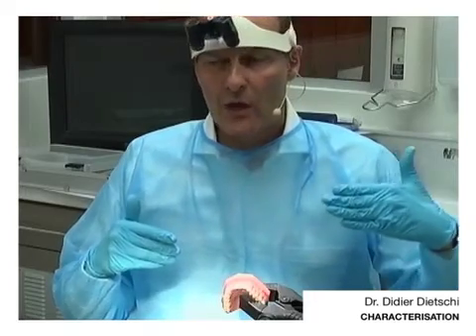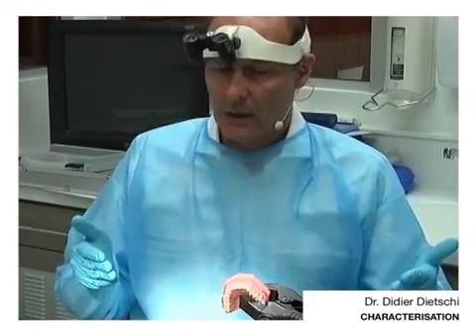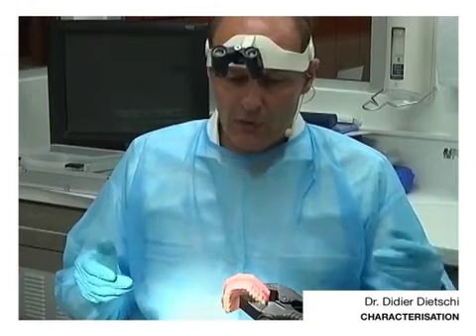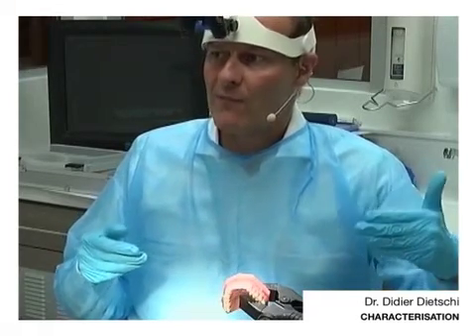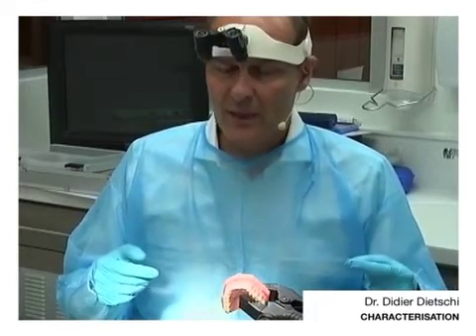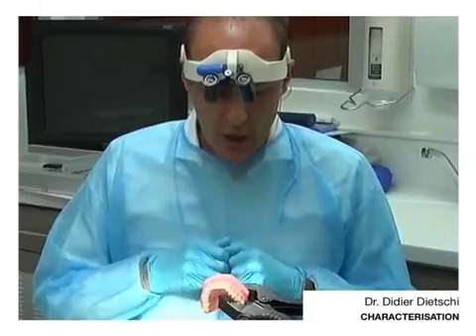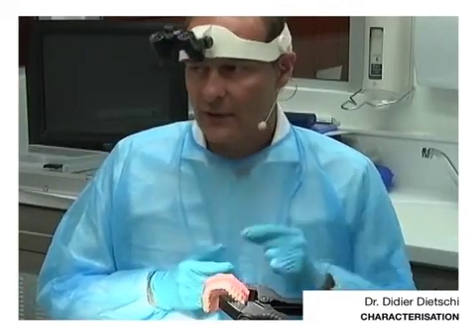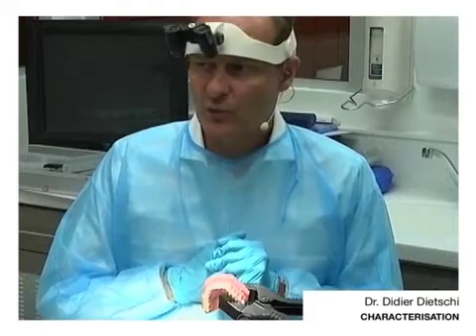So what are the options? Either to go with the classical ceramic porcelain veneer with all possible characterization, or can we go one step further with this technique? And the answer is that with a little bit of experience — and this is more the advanced use of this system — we can do some internal characterization. I would like to show you briefly how we need to proceed.